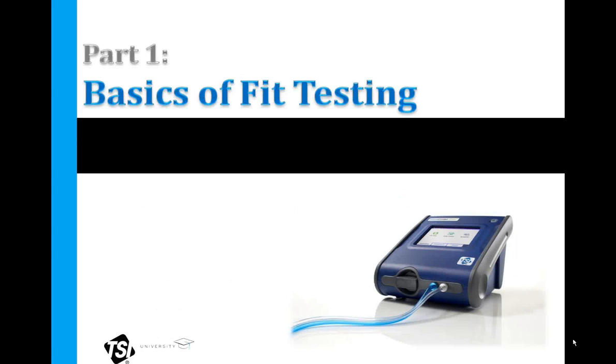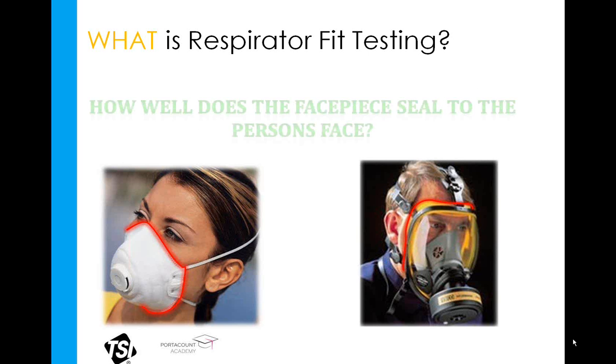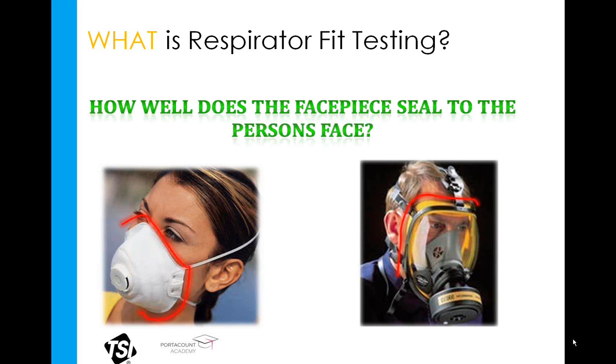As I said previously, we're going to start by doing a quick overview of general fit testing and what that entails. So what is the purpose or definition of respirator fit testing? Literally speaking, it's the practice of determining how well a particular respirator, a particular make, model, and size, fits to a specific person's face. I want to be clear here what respirator fit testing is not.